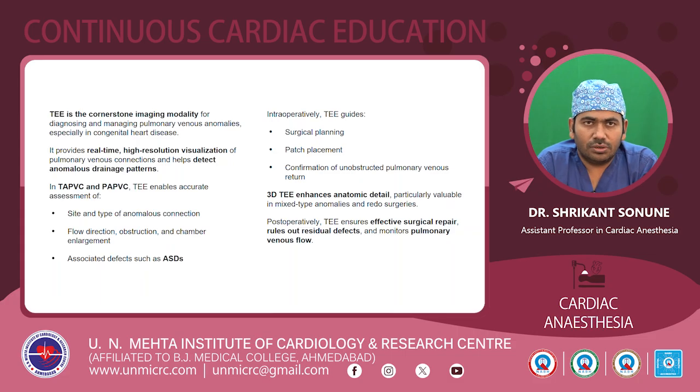TEE is the cornerstone imaging modality for diagnosing and managing pulmonary venous anomalies, especially in congenital heart diseases. So it provides real-time imaging as well as high resolution and visualization of the pulmonary venous connection, and it helps to detect the anomalous drainage pattern. So in case of TAPVC and PAPVC, the TEE enables accurate assessment of the site and type of anomalous connection, the flow direction, the site of obstruction and the chamber enlargement.